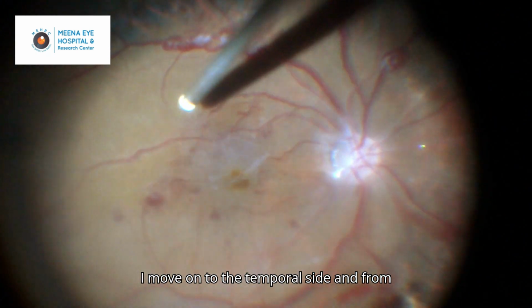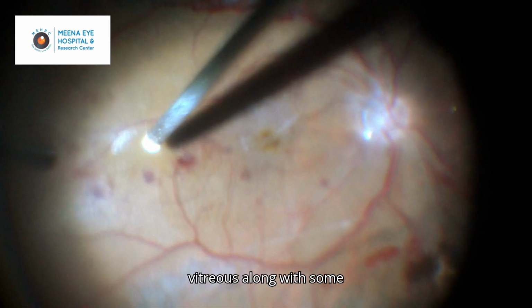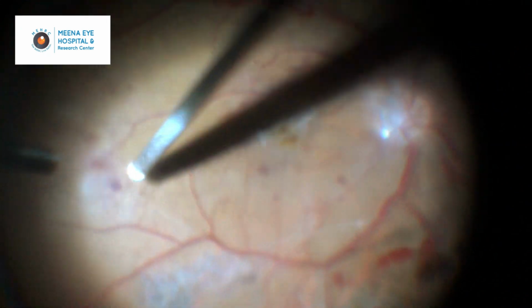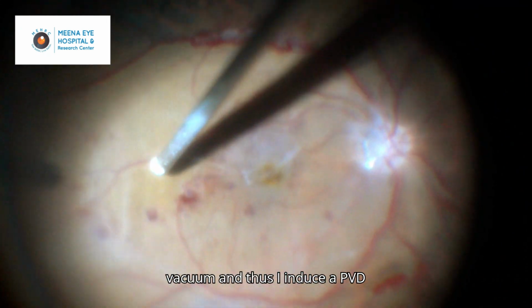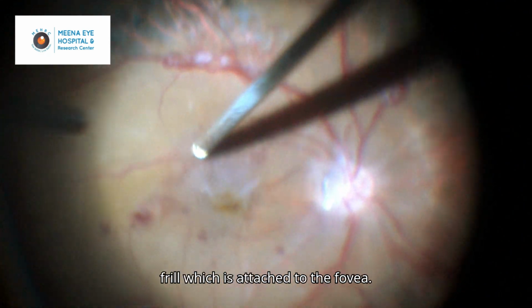Post this, I move on to the temporal side, and from here I am just gently trying to cut the vitreous along with some vacuum, and thus I induce the PVD along the macula and separate the central frill which is attached to the fovea.